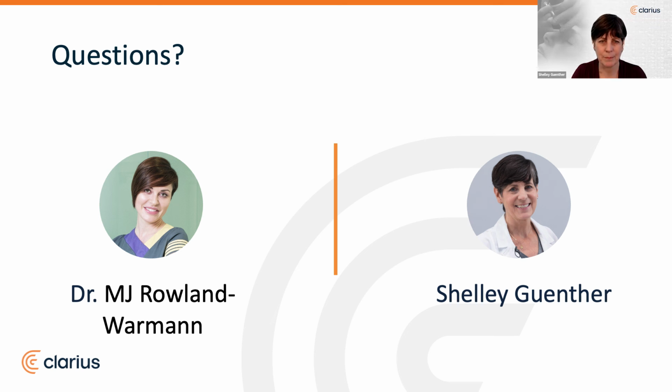And I can just kind of speak a little bit more on that. If you just remember with the physics of ultrasound, if you are using a scanner and your needle is coming in perpendicular to the sound beam, you're going to see that better, which is going to be the case in most of your superficial imaging. So the deeper you go, the more steep angle that your needle is going in, the more difficulty you may have in seeing the needle. There's a few little tips and tricks to that. But generally with facial injections, you're going in quite parallel to the scanner head or perpendicular to the sound beam. So it really does help to see the needle a lot better.